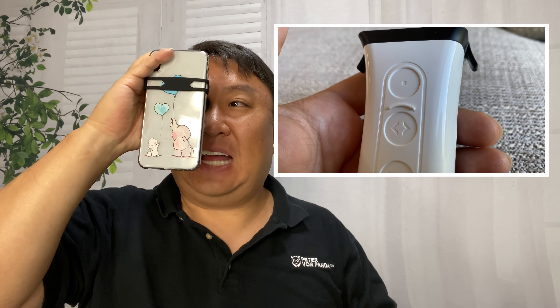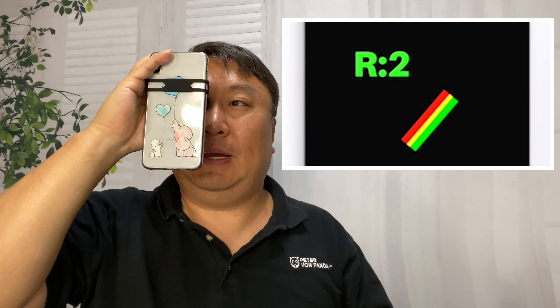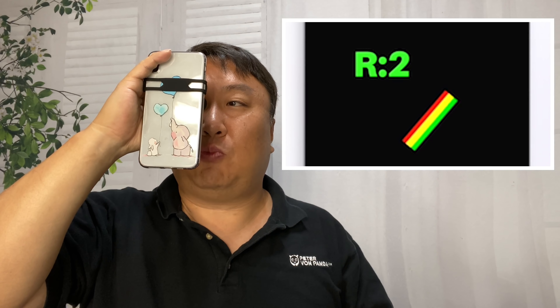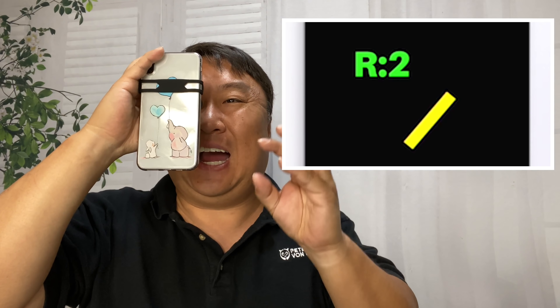Then you're going to hit that farthest third button to complete that step. The lines are going to reorient and you may have to move your pupil around a little bit to see them, and then you go through the process again — using those two buttons in conjunction to dial it in. Then it will have you go through those same steps on the other eye.